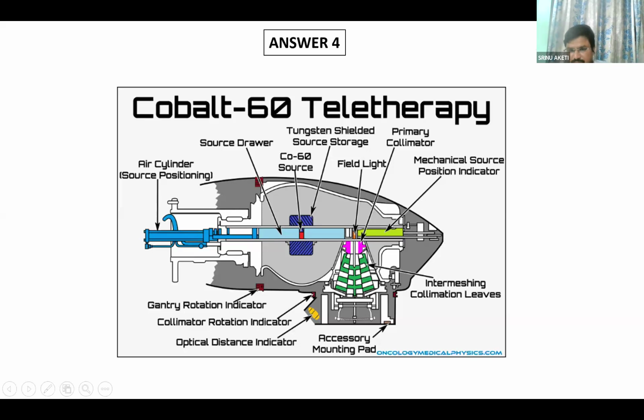Any idea about T rod? Yes, sir. It is used to place the source in the safe position when there is an emergency, when the source didn't go to its safe position. So this rod is still outside. You have to go and insert your T rod into this rod and push it hard until the white one should show here. The white color should show here only. The red and yellow should be completely inside. Okay, next you can go on.